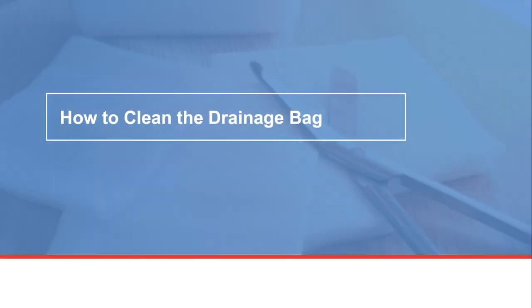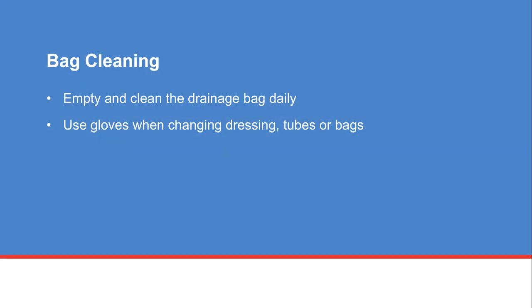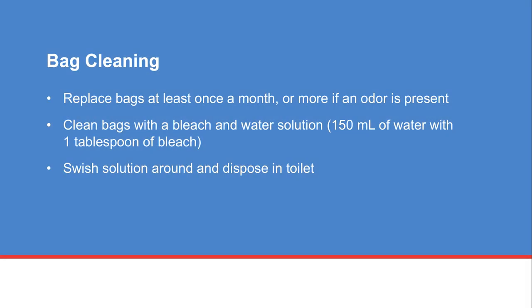Next you will learn how to clean the bag. You need to empty and clean the drainage bag daily. Use gloves when changing dressings, tubes, or bags. Replace the bags at least once a month or more often if an odor is present. The bags can be cleaned with a bleach and water solution — mix 150 milliliters of water with one tablespoon of bleach. Swish the solution around in the bag and dispose of the solution in the toilet.